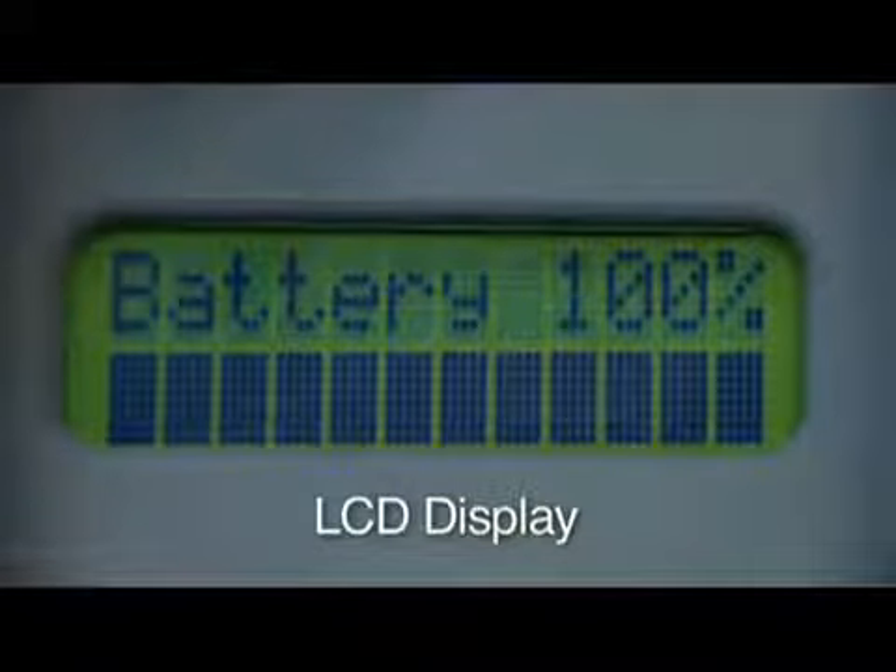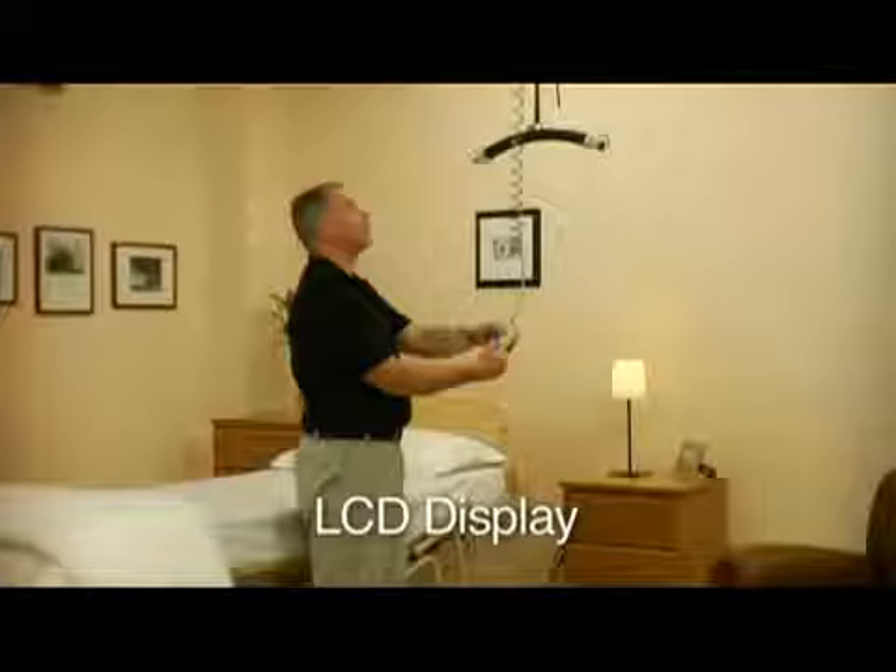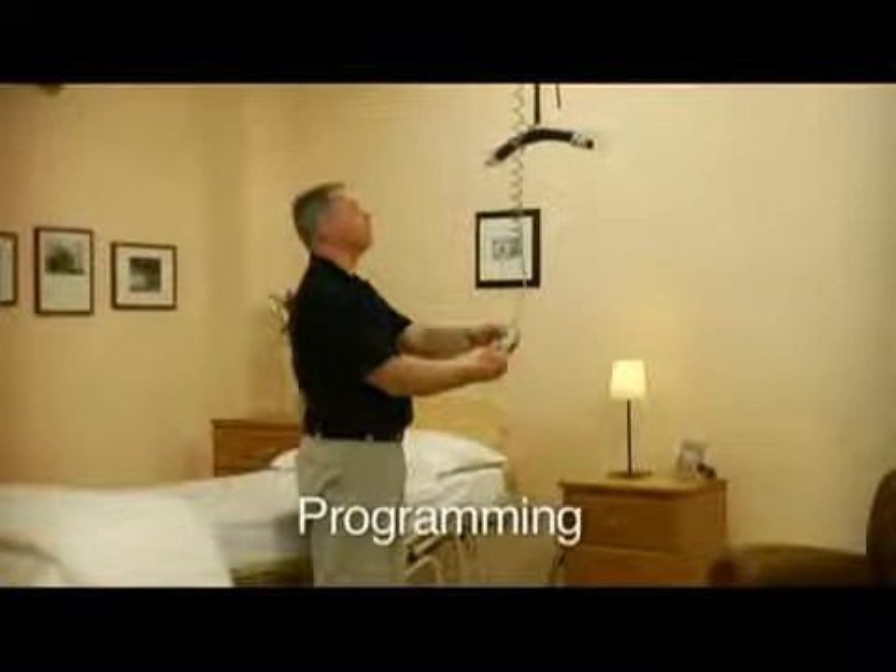The LCD display gives you immediate information regarding how much power remains in the unit. Here you can see the unit is at 100%.